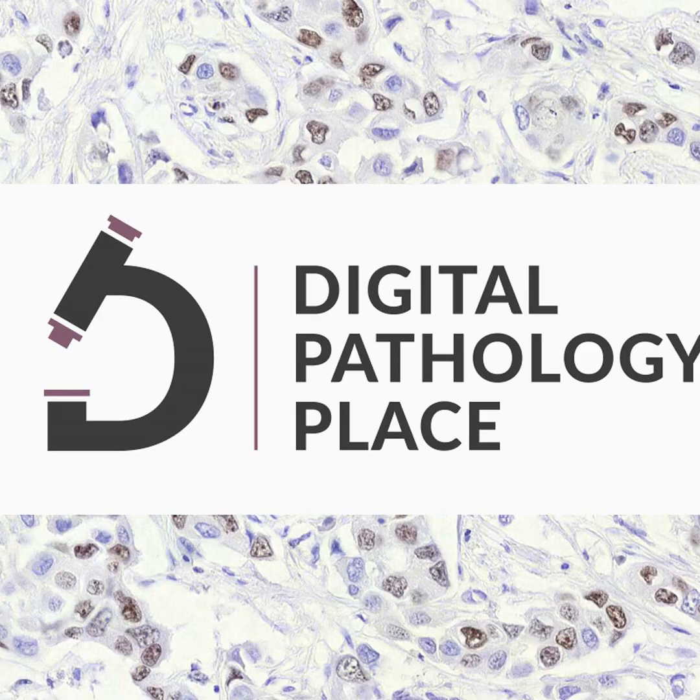Well, you're definitely ahead of the game by understanding that there's a problem and that there are some solutions. But there are 5 different ones that I'm aware of that I wrote about in this article. One is stain normalization, like you said. So the goal is to make the target domain images look similar to the source. So in the case of H&E, make the hematoxylin and eosin stains look similar between the target and source domains.